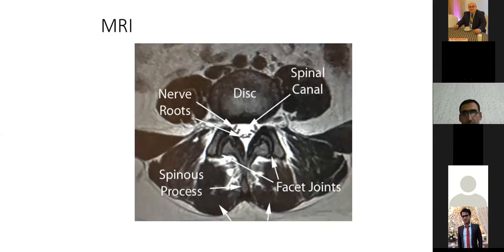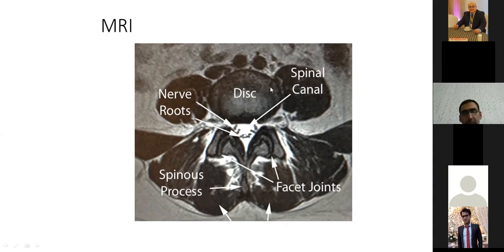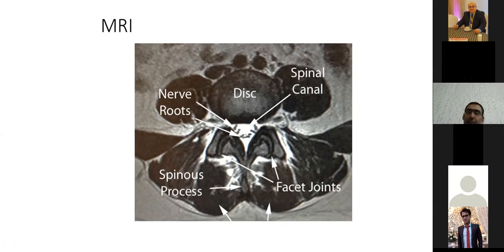On the axial slice, you can see common labeled structures: the disc sitting over the end plate, the large psoas muscle bellies on either side, the spinal canal (the entire space containing CSF), and if that CSF is bright it's a T2 sequence. In routine practice, we don't do axial T1 unless it's post-operative or tumorous. Routinely we do axial T2 for nerve root impingements. For inflammation, infection, or tumor, we add STIR sequence.